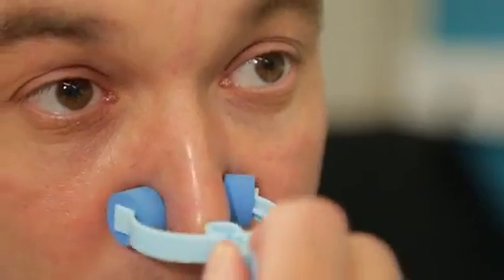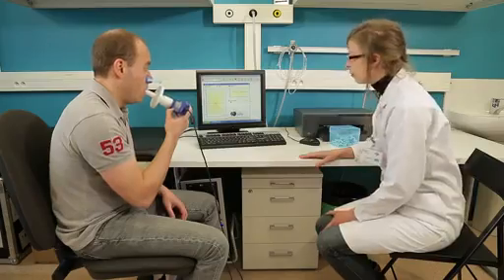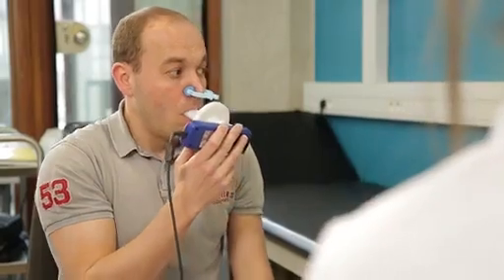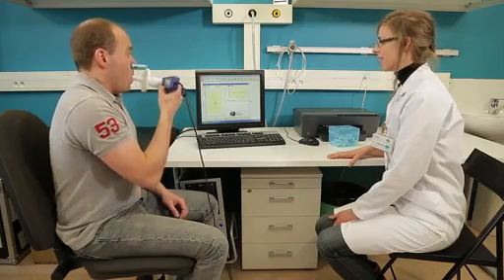Before inducing sputum we need to perform a spirometry, which is an assessment of the volume and the flow rate that the patient is able to produce. We need to do that because the sputum induction by itself may cause bronchospasm, so we absolutely need to know the baseline value of the spirometry of the patients.